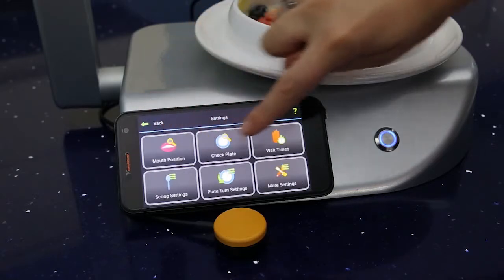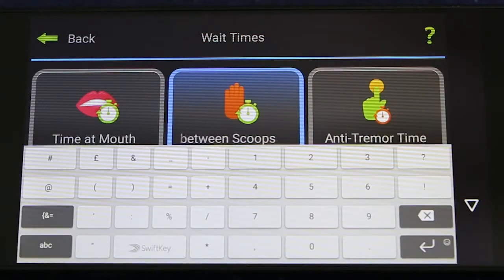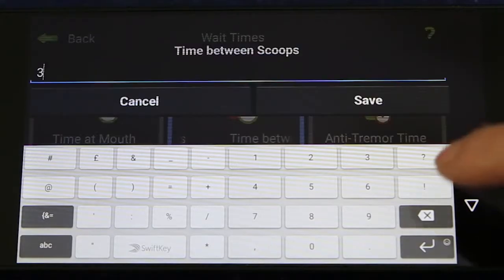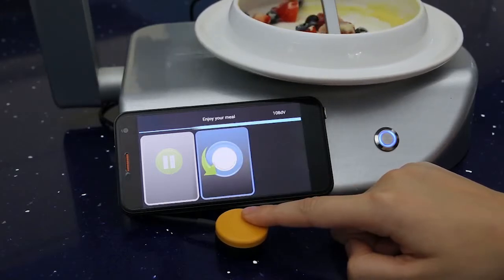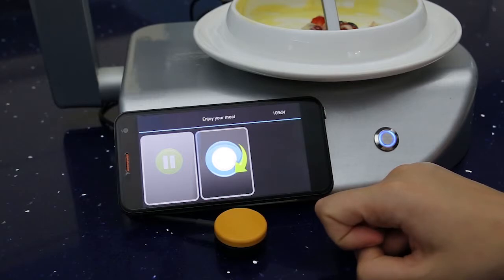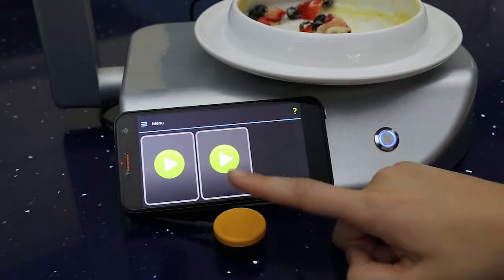I would also go into wait times to give myself a longer wait time between scoops, so I can turn the plate to line up food for scooping. Then, during the wait time at rest, this button is a plate turn button, so you can line up the food to choose what you want to eat. When the wait time is over, the middle button is a play button, so you can control the Meal Eater with just one button.